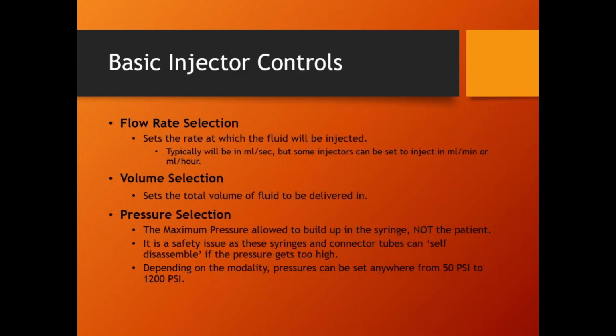Because, to be honest, the connector tubings will more than likely pop off before we get to that kind of pressure outside the syringe. It'll hold here, but these are designed to break away from the T-box at like 400 PSI or something like that, because it's never intended to have that much pressure outside the syringe. But you never know. Hundreds of thousands of these are done a day. There's always going to be one wild card.